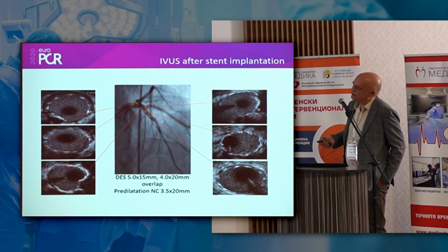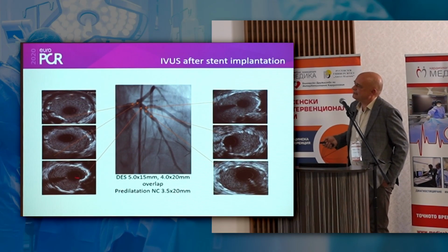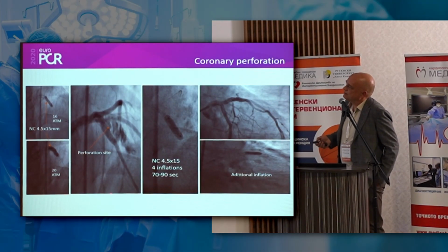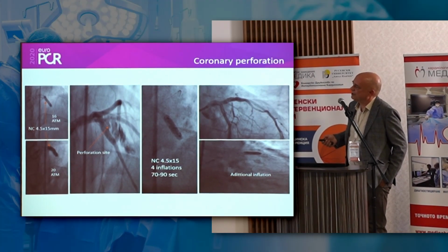We have good apposition at the point of the hard calcium, but we tried to open that stent some more, and we chose a 4.5 balloon, and we were pretty aggressive here.